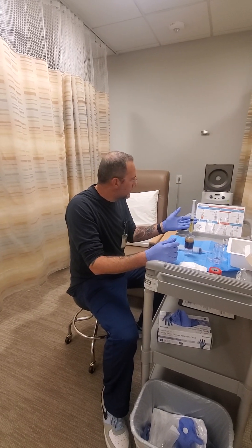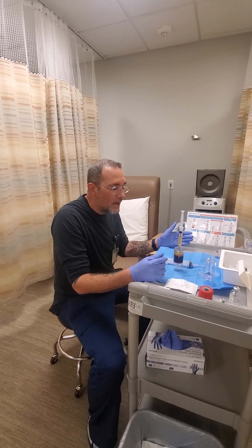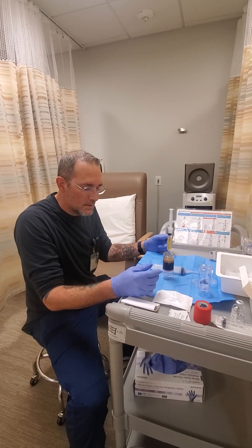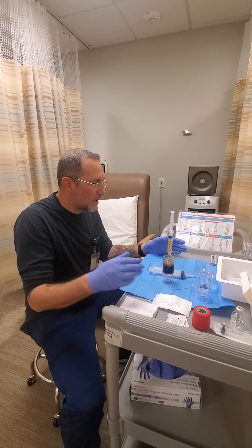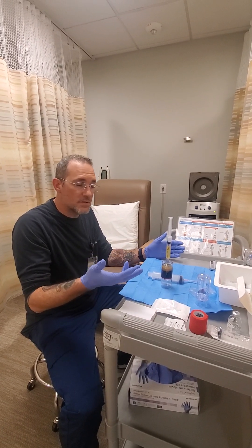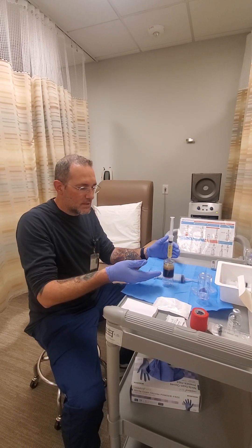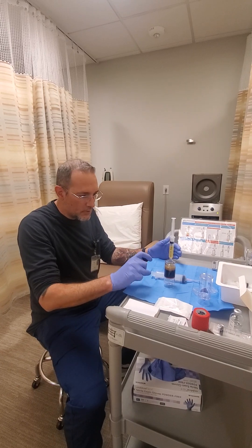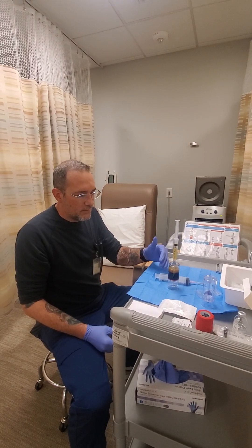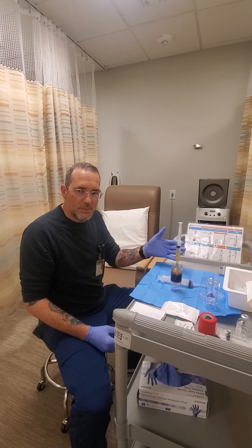Hi there! So we are in the middle of doing a PRP. This is a 60 ml Pure 2 kit that we're doing this for. Essentially what we've done to this point, I drew 60 cc's of the patient's blood. We then put it into this container here, which is used to spin it down to separate the plasma from the red blood cells. So that first step's already been completed.